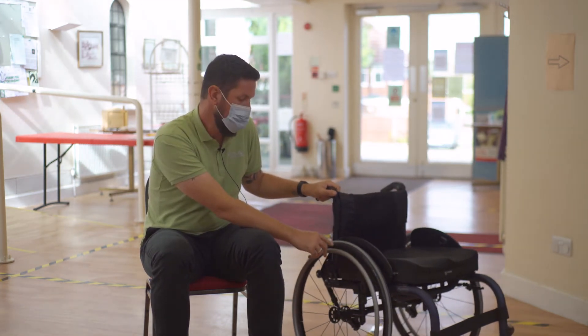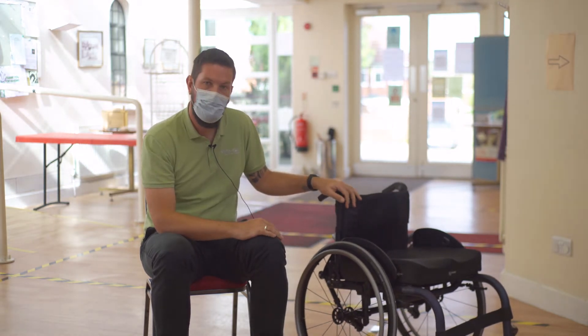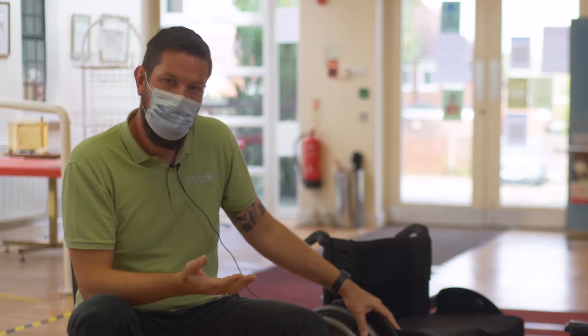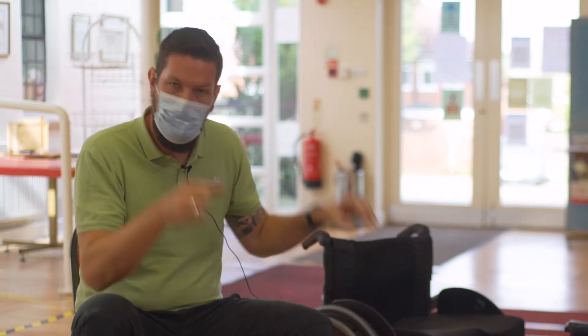These are normally quite high pressures and are hard to achieve with a manual hand pump. We recommend using a track pump, which you can buy from a local bike shop. But as wheelchair users, you may find an electric pump is more usable, as you don't have to apply any pressure down into the pump itself.